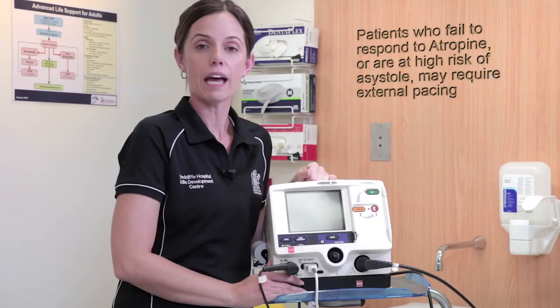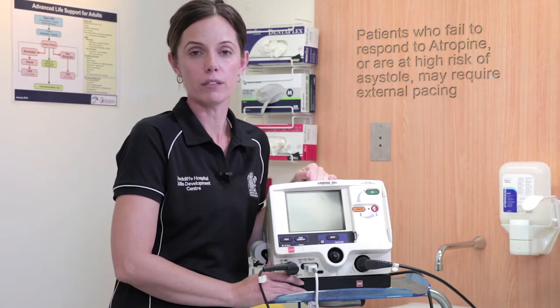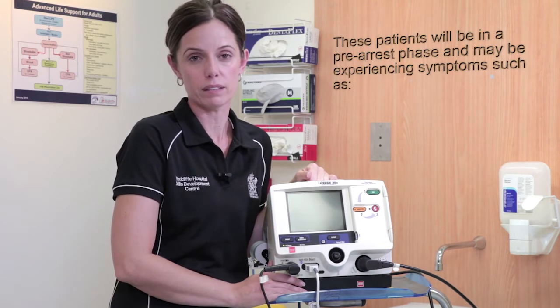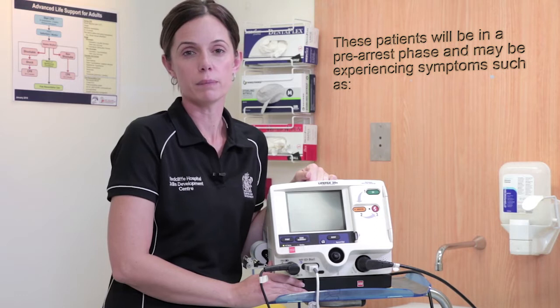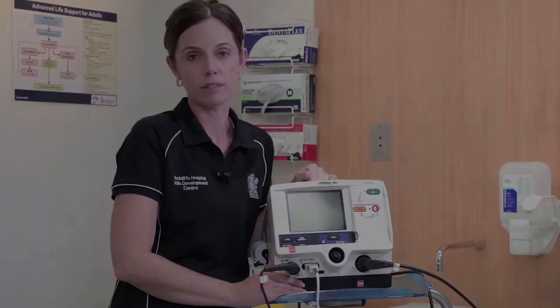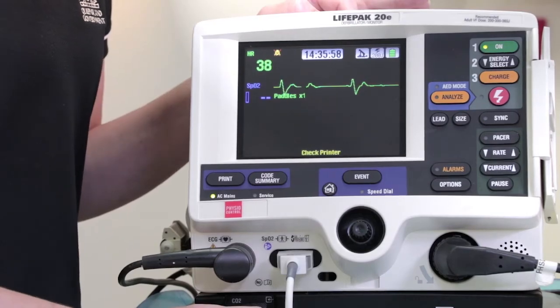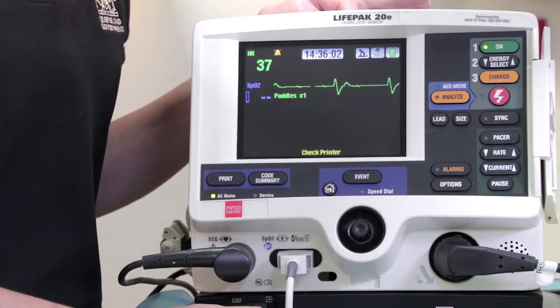According to the ARC's bradycardia algorithm, patients who do not respond to atropine or are at high risk of asystole may require external pacing. These patients are in a pre-arrest phase and may be experiencing symptoms such as hypotension, shortness of breath, dizziness, and/or chest pain. The LifePak 20E, as well as the 12 and 15, has the capacity to provide external pacing via the defibrillation pads.